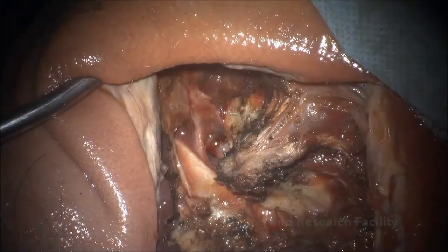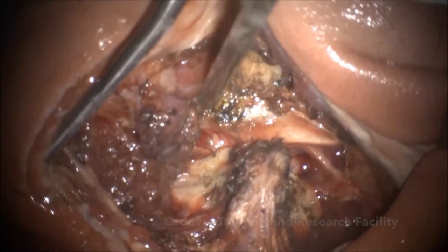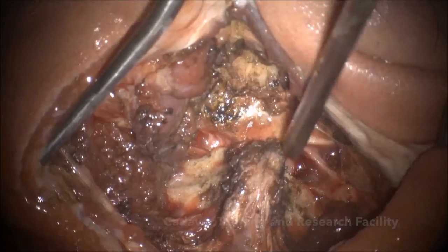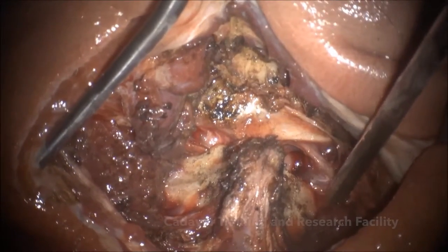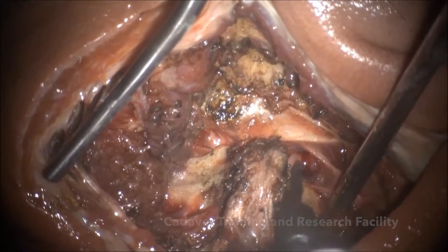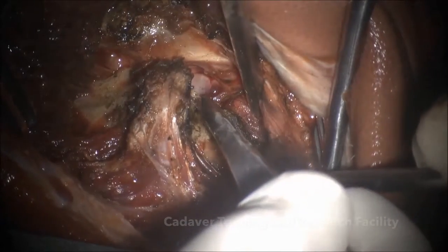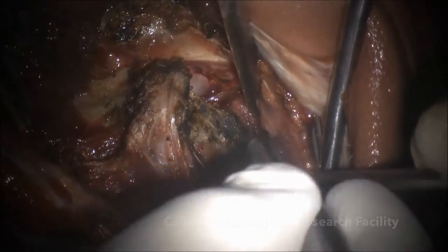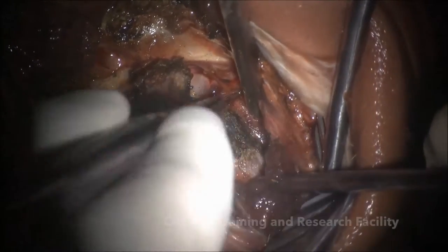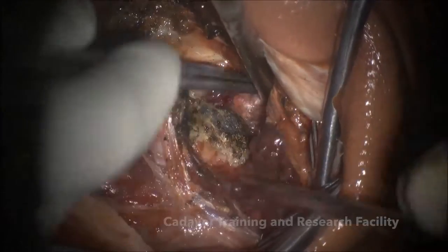I can show exactly how to expose the facet joint. This is the cranial part; this is C1 on the right and this is C2. First thing you have to do is trace a lane which becomes the road. The lane is the upper border of C2 — you trace it and go laterally, so the lane becomes a road. This is the lateral part of the road, this is the middle part, and we have reached the house which is actually the facet joint.